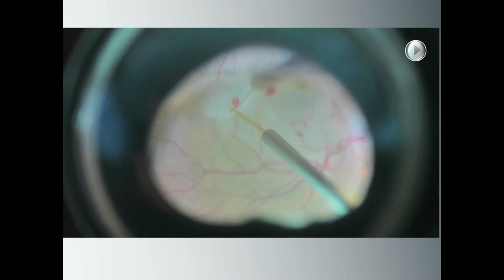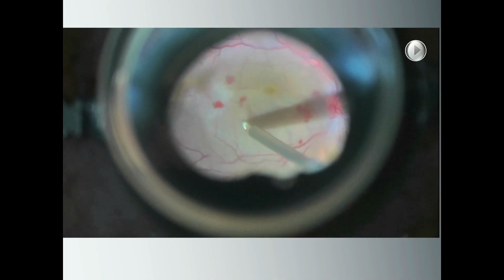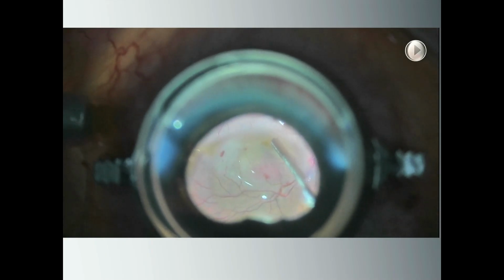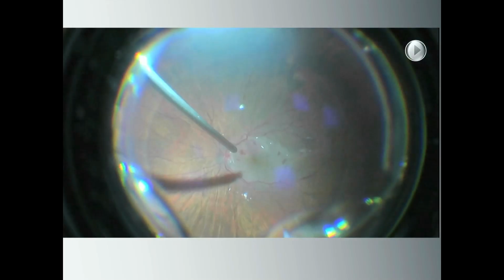And then the injection of the subretinal space with BSS with a 41 gauge mechanically assisted injection. And I attempt with a Thanos scraper to gently unfold this macular fold, and then with the aid of PFCL, the procedure is repeated. I think this helps to some extent to diminish the damage on the retina, and you can see how now the fold has gone and the problem is solved. Thank you.